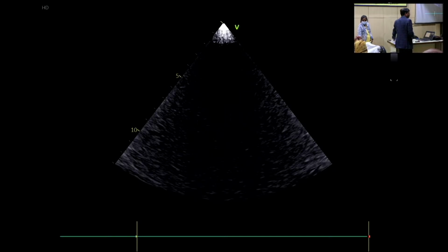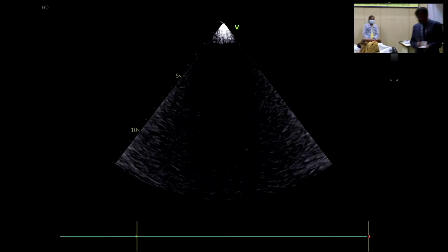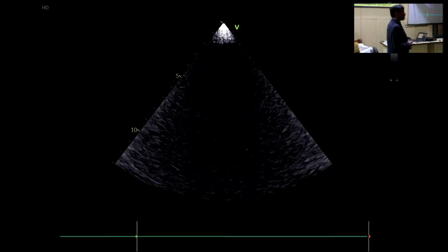Even if it's a bicuspid, how is it going to be different? The only natural thing is you can look at the flow velocity. That's all. So if by this stage nothing has happened for the bicuspid valve, it's unlikely to cause trouble. This doming also is maybe due to hypertension? Which one? Doming means? Doming can never be due to hypertension.